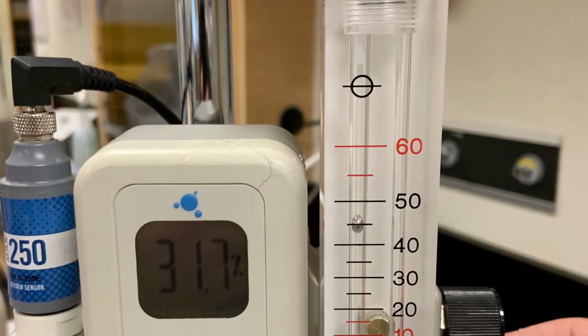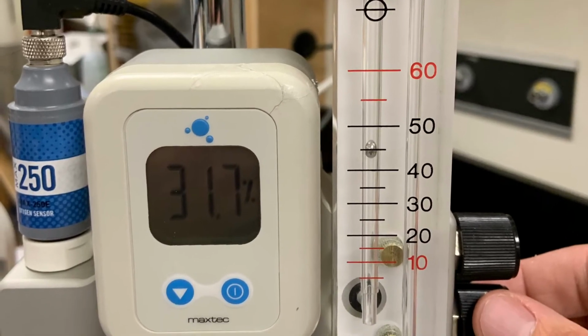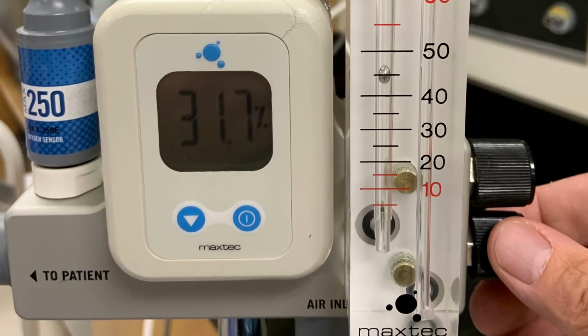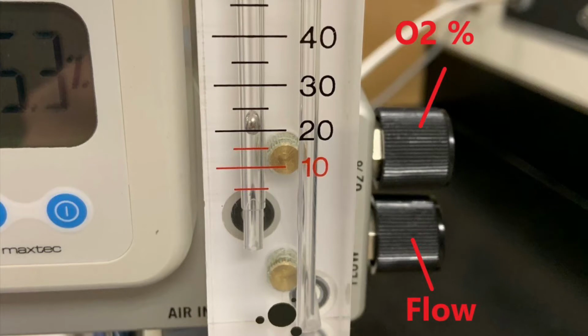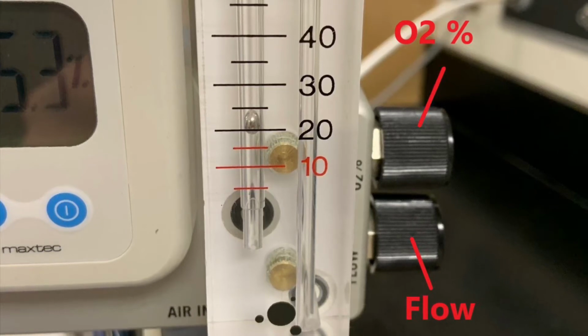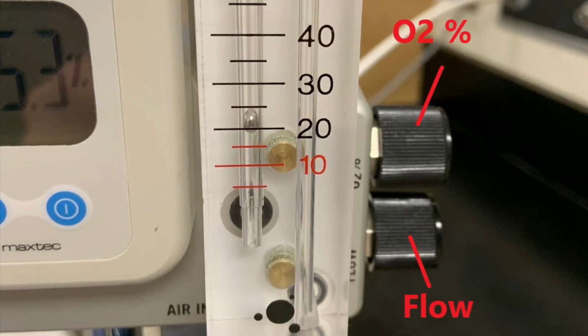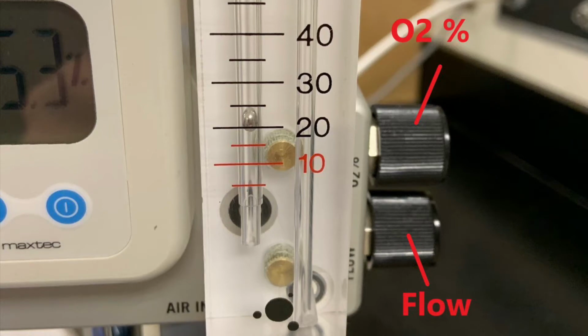Here's a close-up of the Max Venturi blender, the oxygen analyzer, and the flow meter. You can adjust flow and oxygen percentage on the right side of this device. Set your flow first and then set your oxygen percentage, because changing flow will affect oxygen percentage.